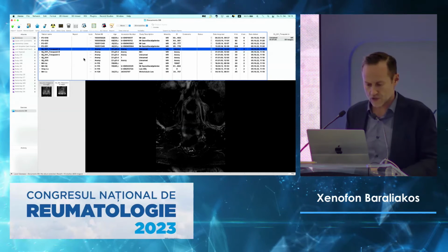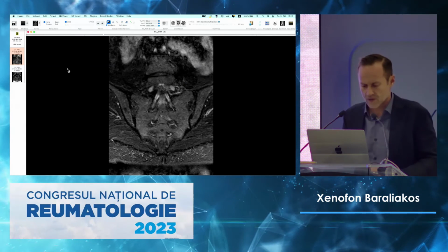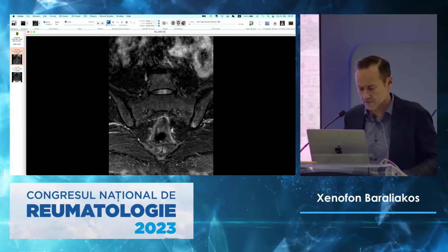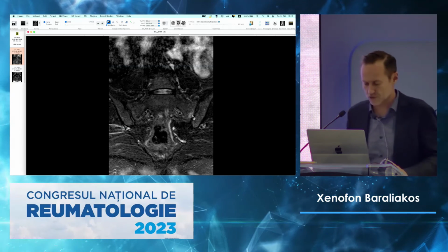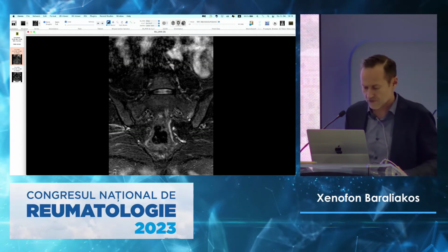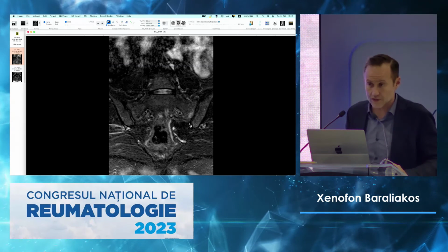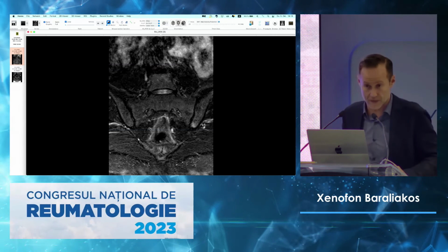This is now another patient. I've just taken some patients here to demonstrate it, where you have a STIR sequence, you have edema here, you have edema here. I don't have the axial images, unfortunately, but you remember, if it is small, if it is in the lower part of the joint and in the anterior part, because this is a bowel, there you would not count it as positive. This is a typical image that I took from a person who is running marathon.